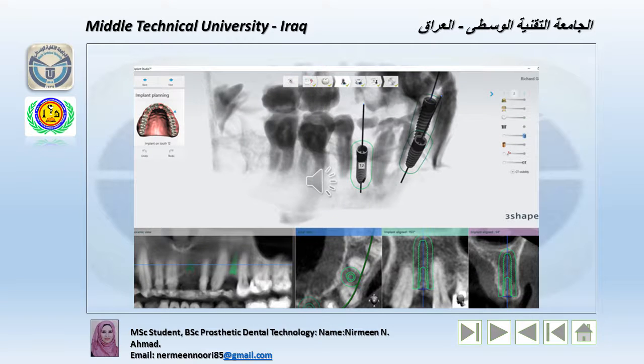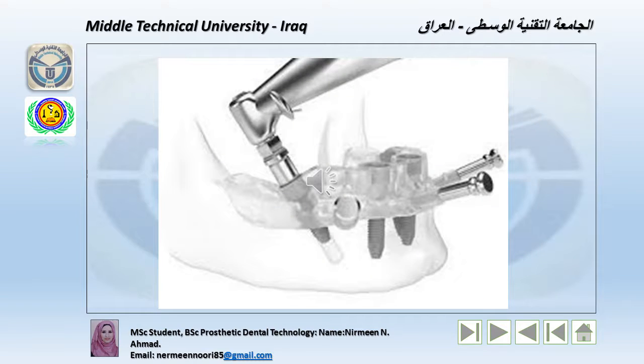The CT scan images are manipulated in specific software, enabling a virtual surgery simulating the implant placement, always looking for the best position, bone anchorage, and, of course, respecting the future prosthesis that these implants will receive. Also, guided surgeries are suitable for the most varied types of rehabilitation with implants.